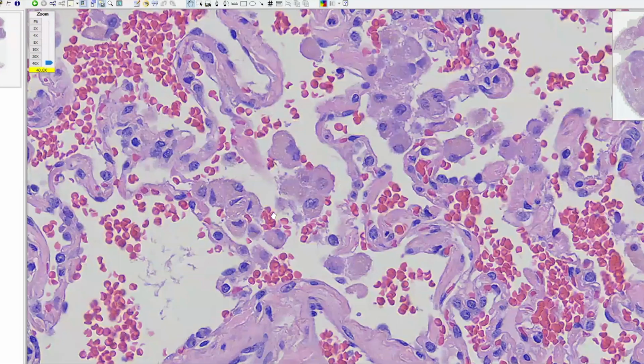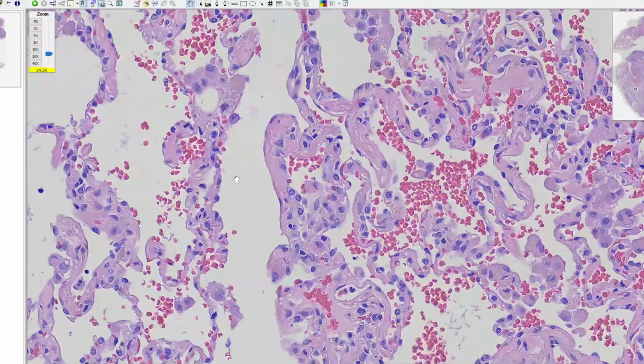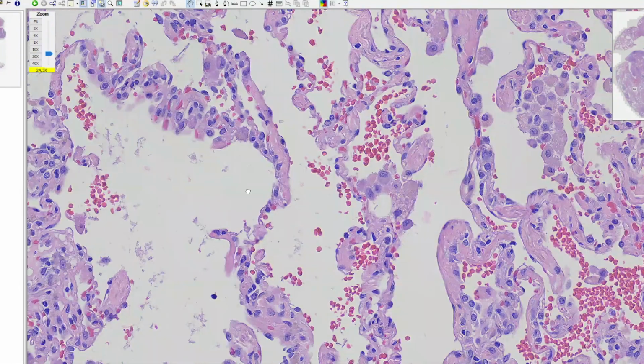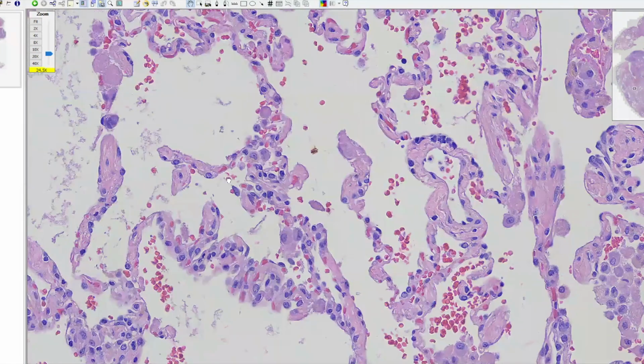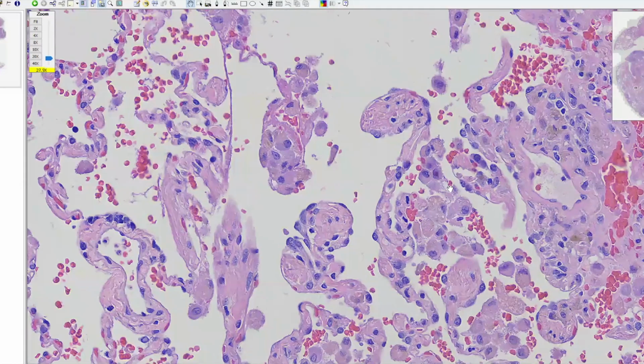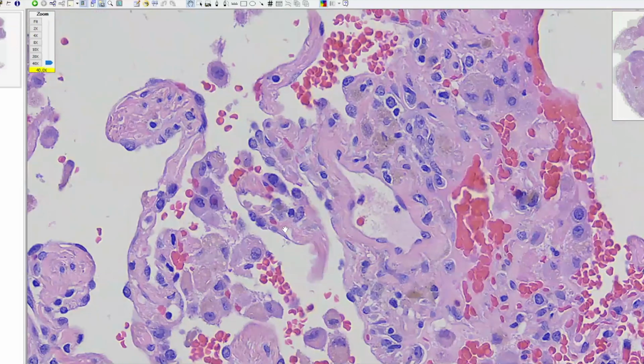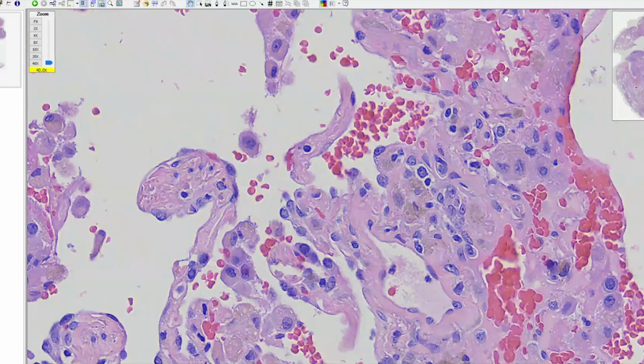This essentially just means that the patient is a smoker. You typically see this in the distal airways and the lung parenchyma surrounding that, and it's really limited to that. A term that we use for this when we see it is respiratory bronchiolitis, which is really just the presence of these pigmented alveolar macrophages that have the characteristic appearance of smokers' macrophages. It's a great question, and we'll talk a bit more about these types of pigments coming up.